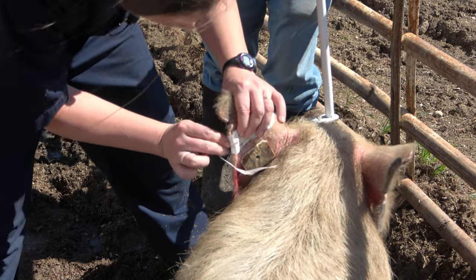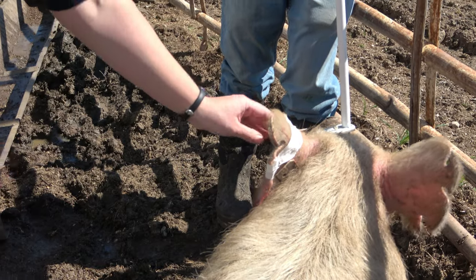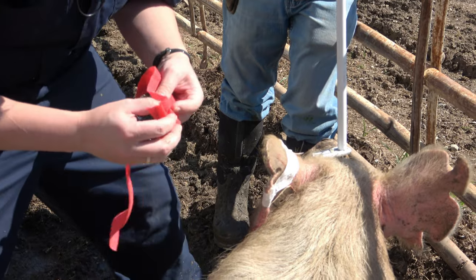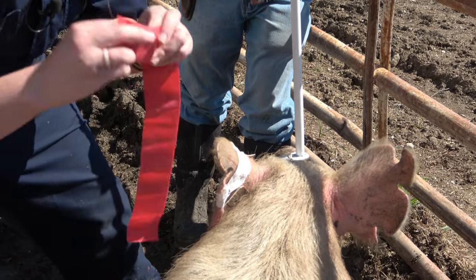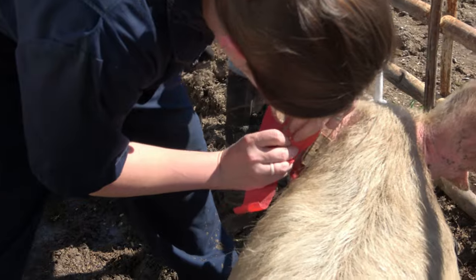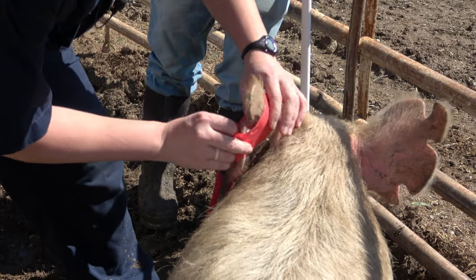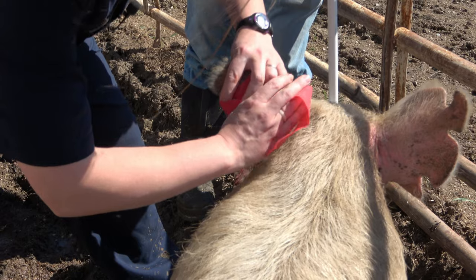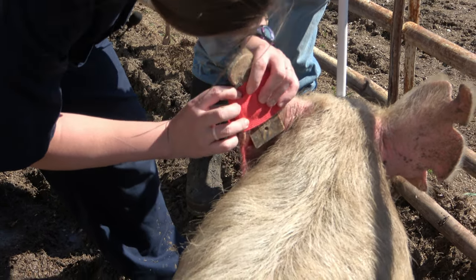And run this guy just on my cap here. And then finally, what I always like to do is place red vet wrap over the top of any IV catheter that I have in place, so it's really easy to see that there is a catheter in place on that animal. I always notch it so I have somewhere for my cap to go through. And for an animal like this that might get a little dirtier, I have a clean spot for access to my catheter port here. Got a little too much vet wrap for this sow's ear, but that's okay.